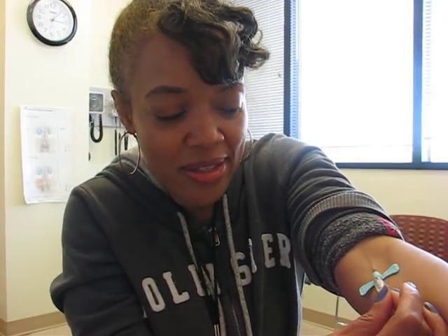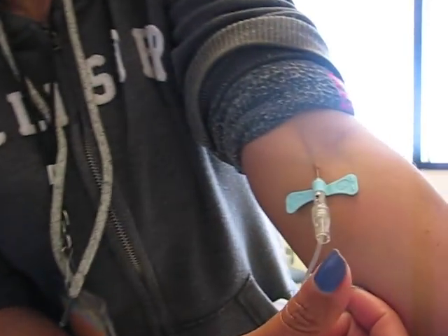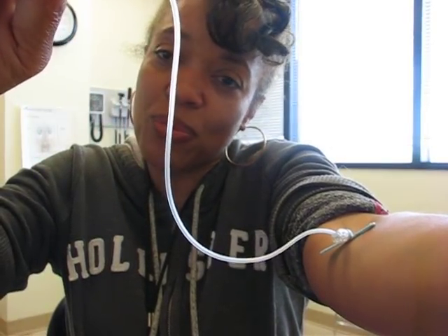So we're going to pull back. We pull back — nothing, right? We put our little tube in the vacutainer holder, we're waiting, we're moving it, we're adjusting it — nothing, right? You know why nothing's coming? Think about this. This patient is hard to stick. So I put the needle in the vein — now I'm waiting for it to travel through all of this tubing. If I get a flash at all or if I get some coming at all, it stops because the vein is small. That's why it stops — because the flow is not there.